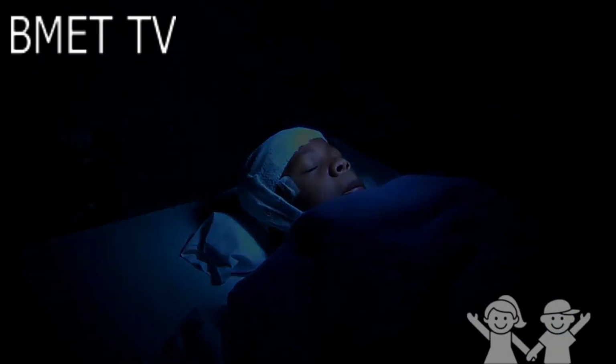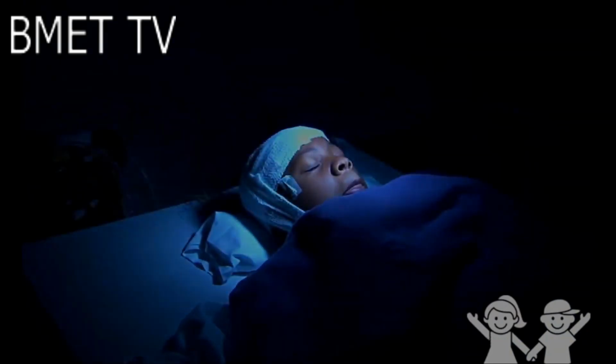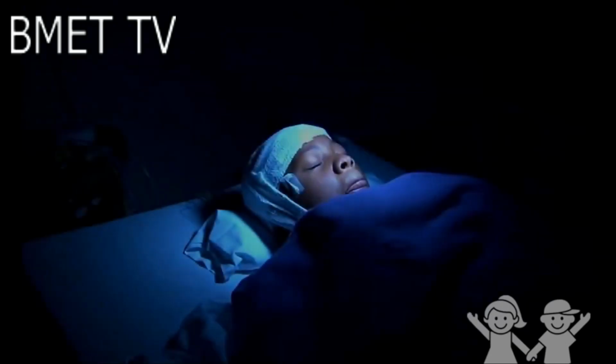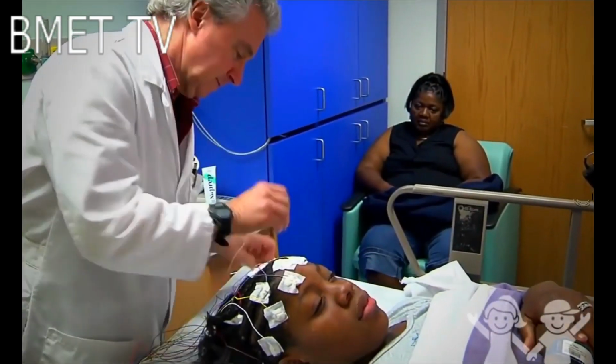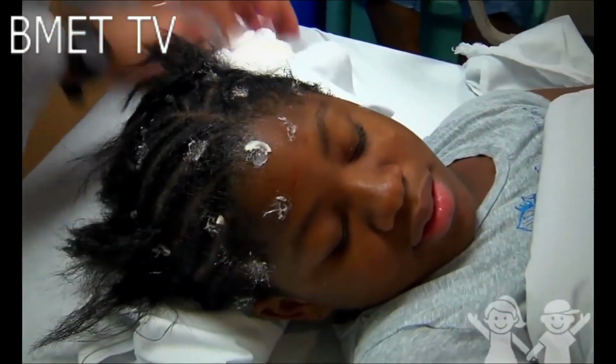Second is sleep EEG, or sleep-deprived EEG. A sleep EEG is carried out while you're asleep. It may be used if a routine EEG does not give enough information, or to test for sleep disorders. In some cases, you may be asked to stay awake the night before the test to help ensure you can sleep while it's carried out. This is called a sleep-deprived EEG.